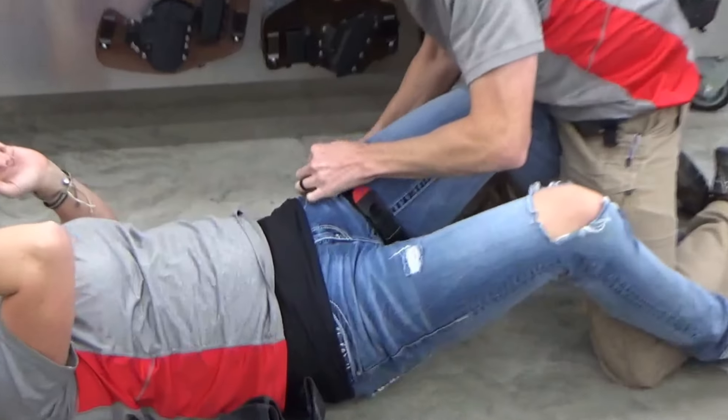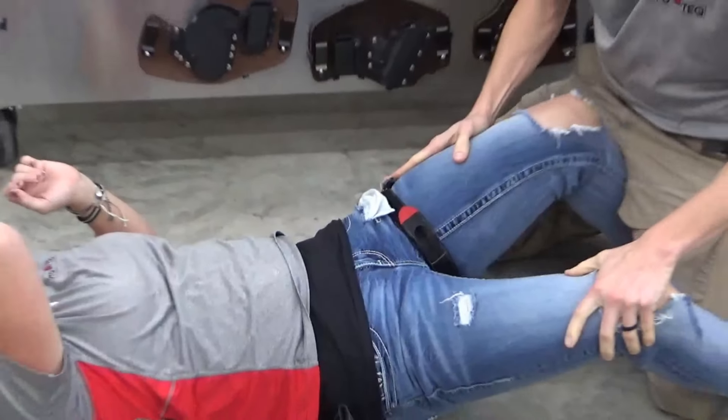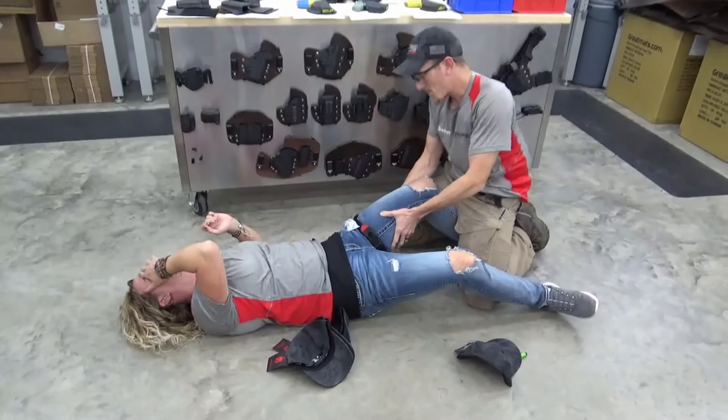Is it tight? Yeah. It's supposed to be. Alright, you good? It's not squirting anymore.